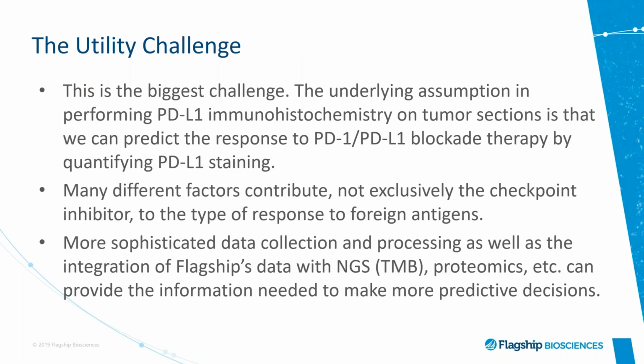Let's start with the utility challenge. This is the biggest one, and the underlying assumption in performing PD-L1 immunohistochemistry on a tumor section is that we can just use the analysis of the slide, and in particular the PD-1, PD-L1 immunostaining, by quantifying PD-L1 staining.